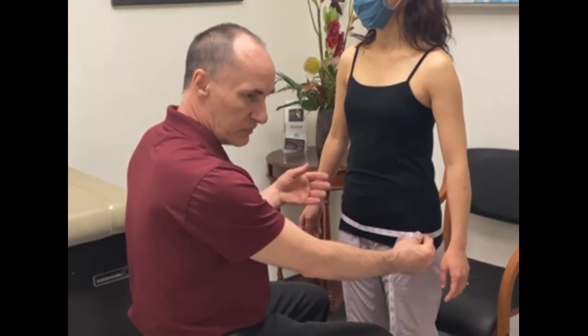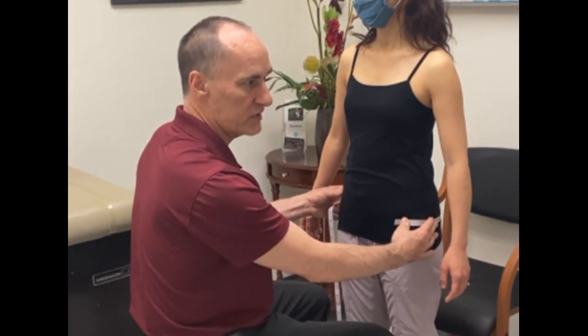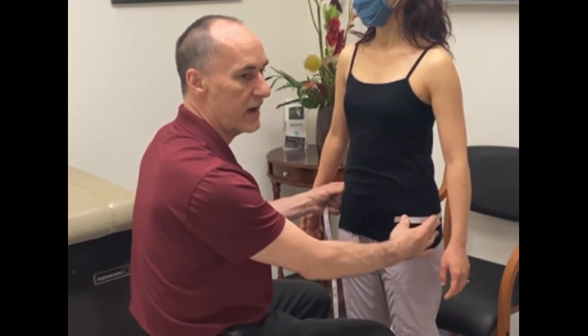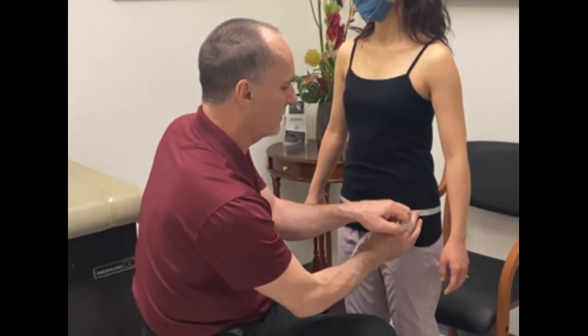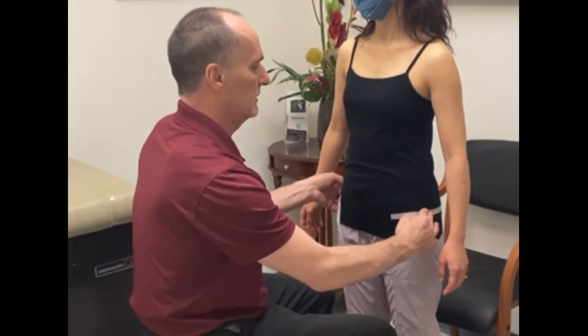Record that measurement and then move up to what we call the three-quarter hip, which is halfway between the ASIS and the greater trochanter. Take that measurement and record it.